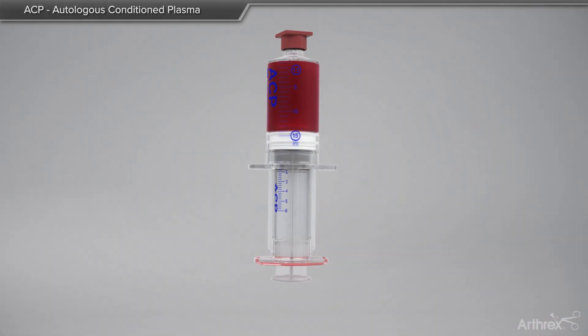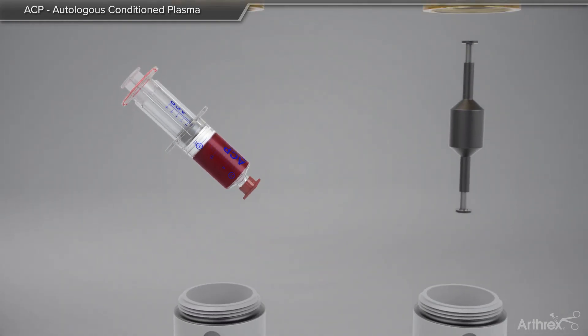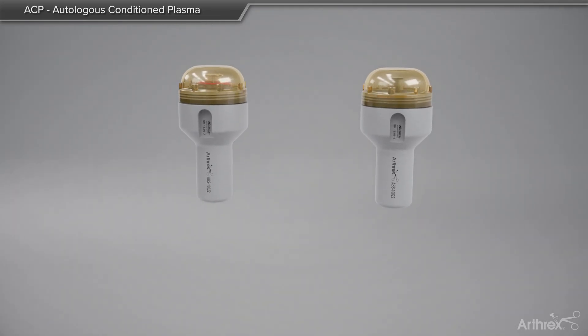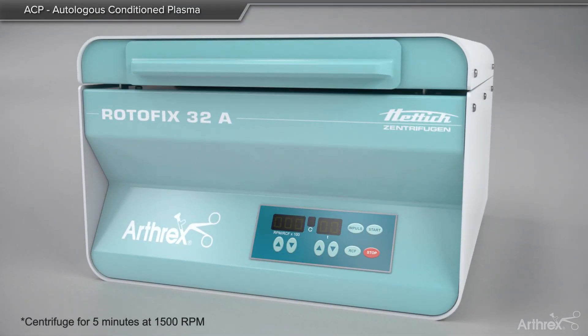When working with a single syringe, you must use a counterbalance for spin and place opposite the double syringe. The blood is spun at a rate of 1500 revolutions per minute for 5 minutes.